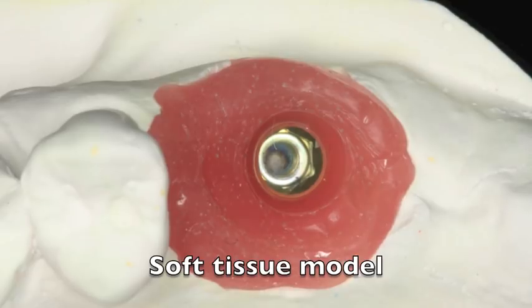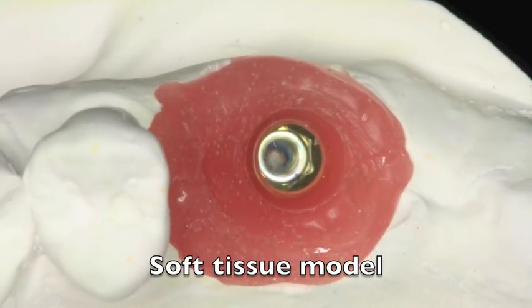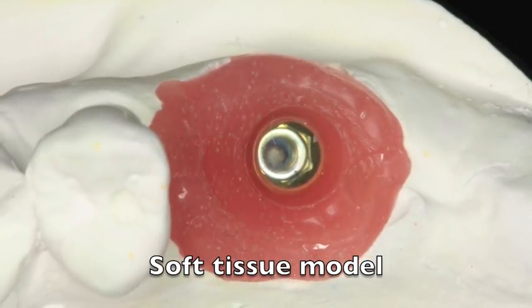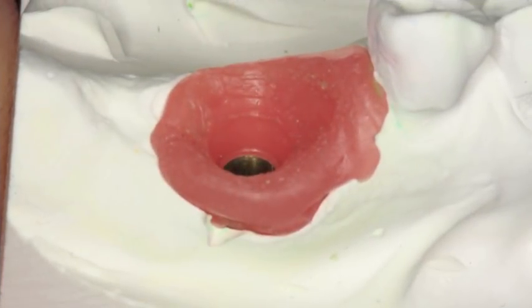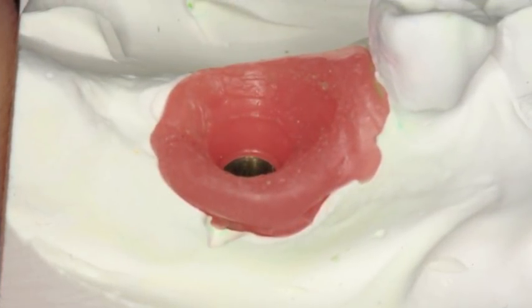During this impression appointment we took an x-ray. You can see the bone looked quite nice here, and you can also see that the emergence profile would have been a problem if we didn't put the healing abutment on and shape it the way we did. So we get this soft tissue model that shapes exactly the way that we wanted the tissue to shape, especially in this case where the implant was not ideally placed.